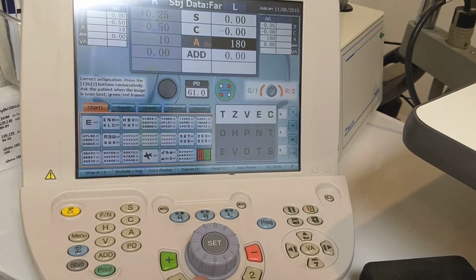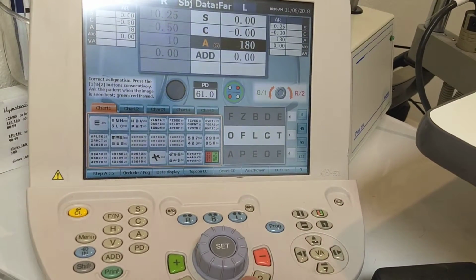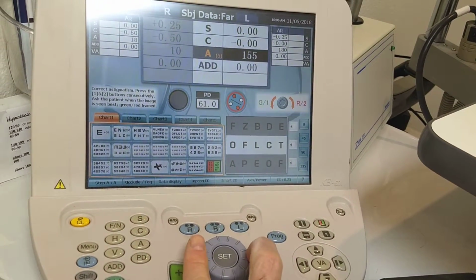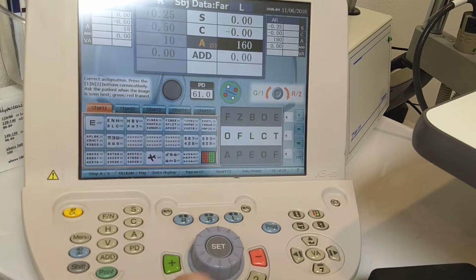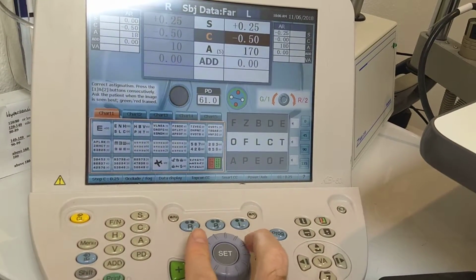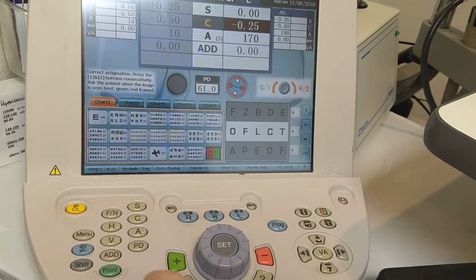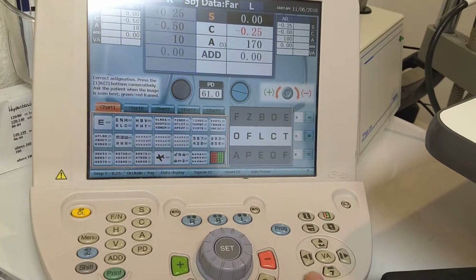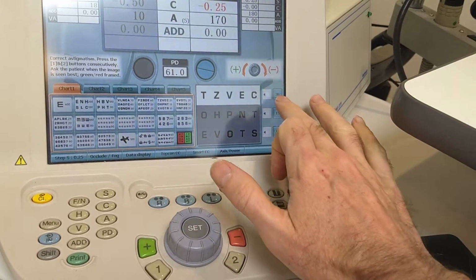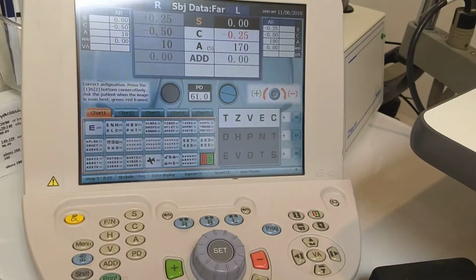Push the 1 or the 2 to make it turn red or green. So is it better with the, you probably want a bigger line, so put it back up to the 20/30 line. Better green or red. Let's say they say red. Better red or green. Green. Guess I didn't have any cyl power in there. Better green, red. Okay, there's our stopping point. Go back to sphere. Go back to the 20/20 line, ask them if they can read that. Like I said, I can't figure out how to make that randomize there. So that's how you do that.